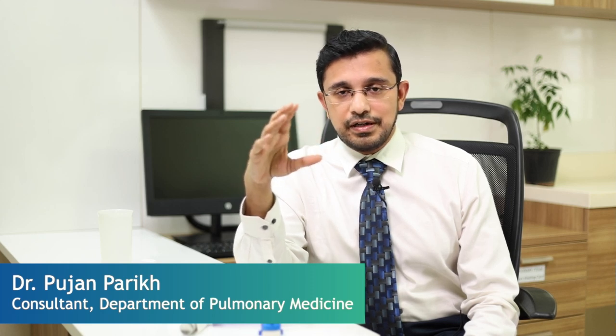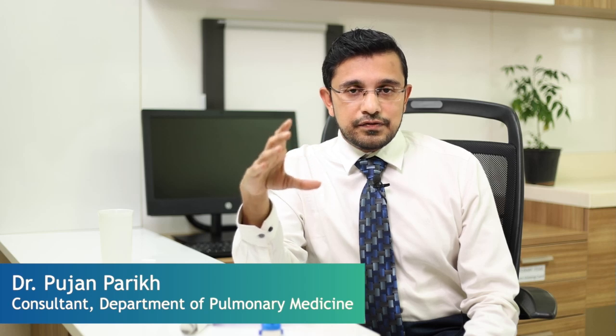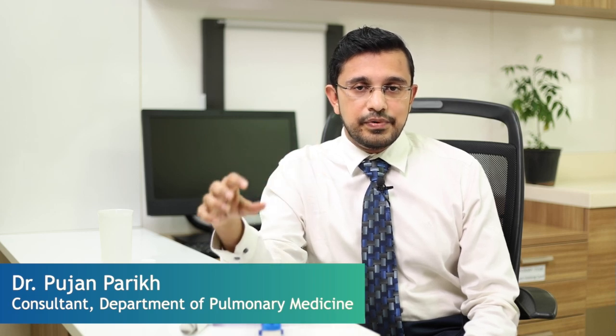Now coming to nebulization therapy. Nebulization is the therapy which we usually use in the hospital, or when a patient is having a very severe asthma attack, or a patient who is suffering from severe asthma. The advantage of nebulization is that no coordination is required. The patient just has to take a deep breath and breathe out.